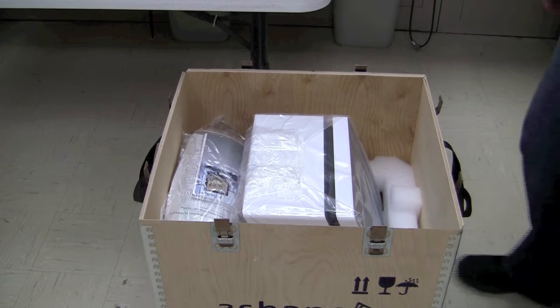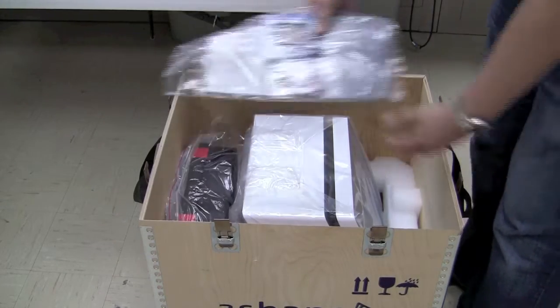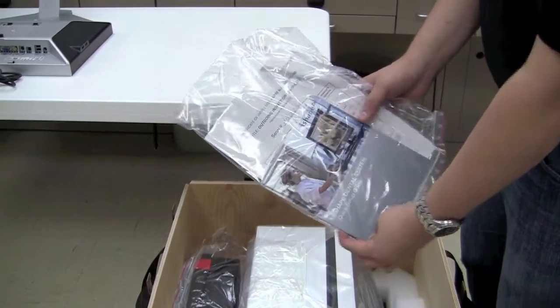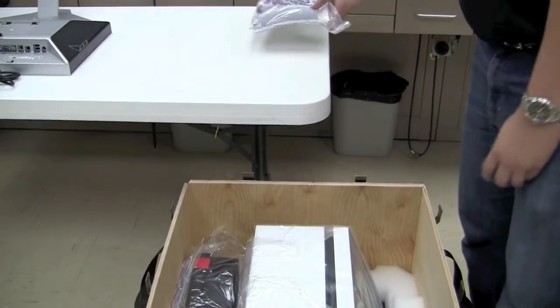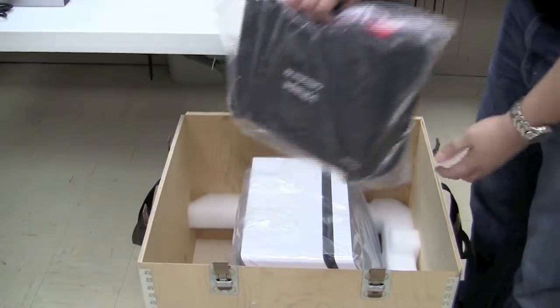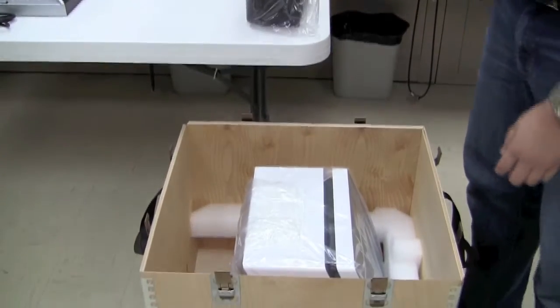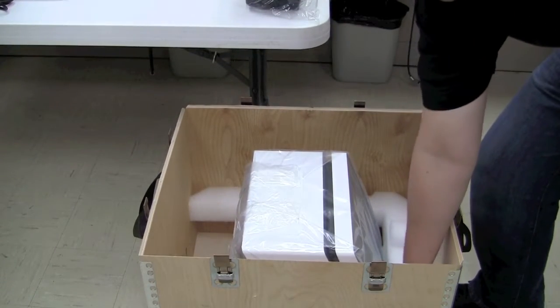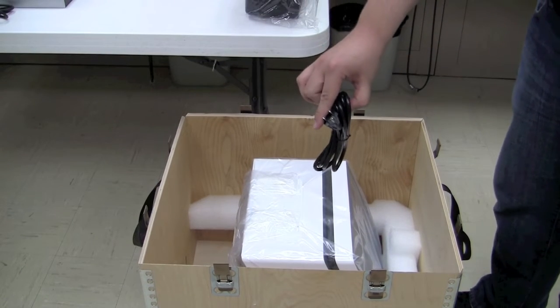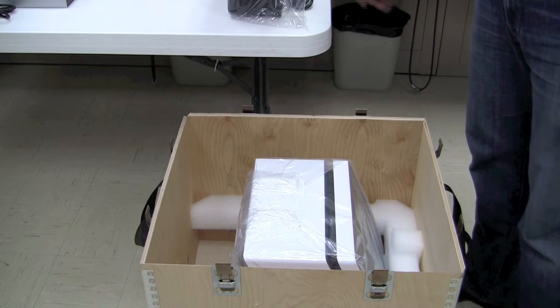Next, we're going to remove some of the documentation that's included with the scanner. Inside, we have a quick setup guide as well as the outgoing inspections of the kit from 3Shape. We also have the calibration kit, which we'll set aside. Also inside the scanner, usually tucked in a corner, you're going to find the power cable for the scanner itself. We'll set that aside, leaving just the scanner by itself in the crate.